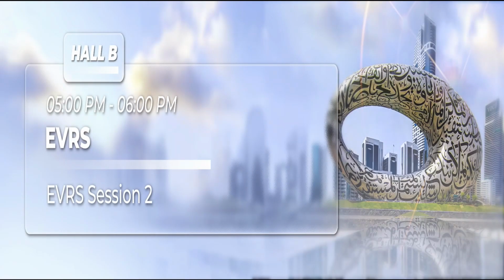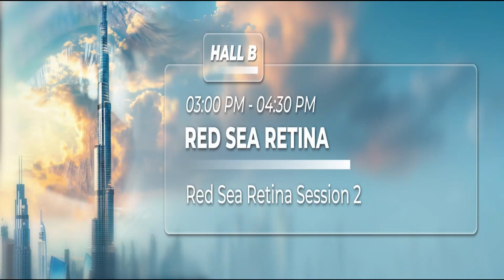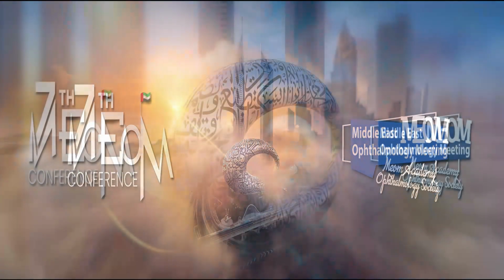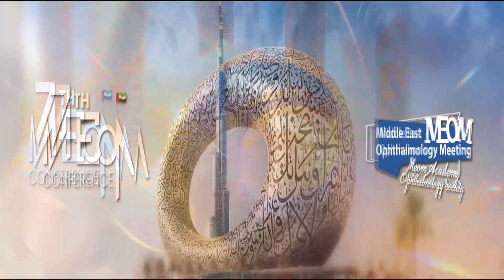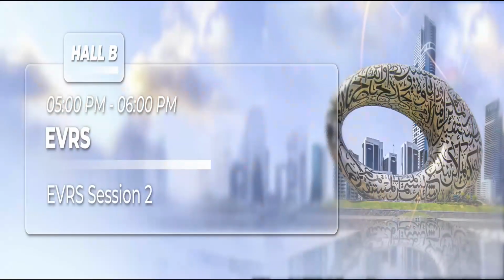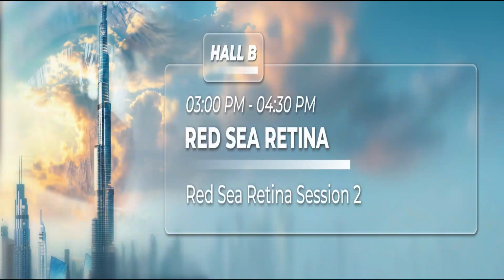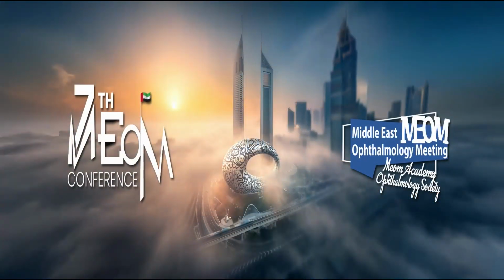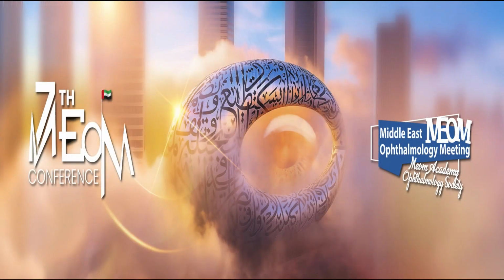Second thing is that I don't find much logic, if you don't have a PVR, in leaving the perfluorocarbon liquid. The reason: the choroid is exposed because of the GRT, already a big tear, a lot of inflammation. PFCL creates more inflammation than any other thing. So you are generating three things that create more inflammation. Inflammation ends in the PVR.